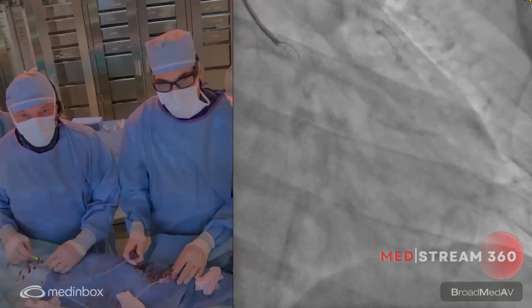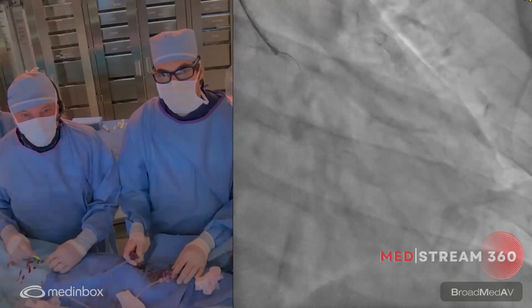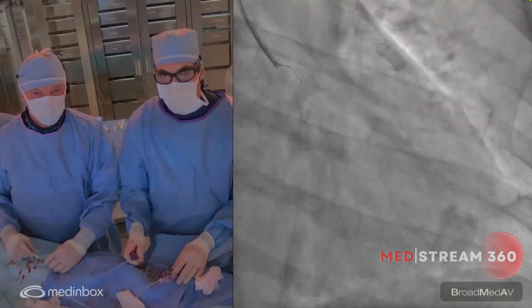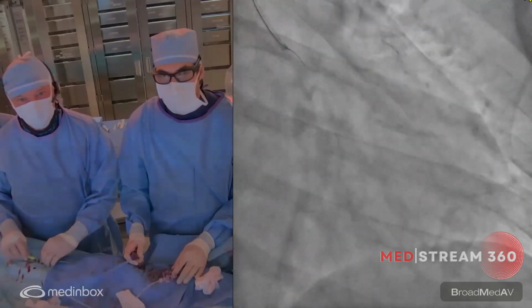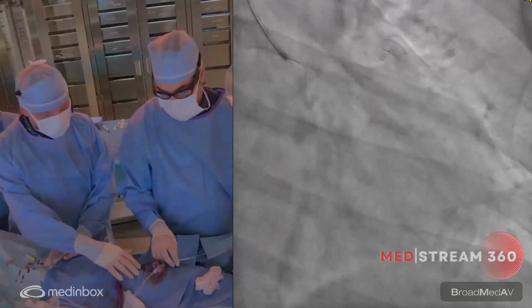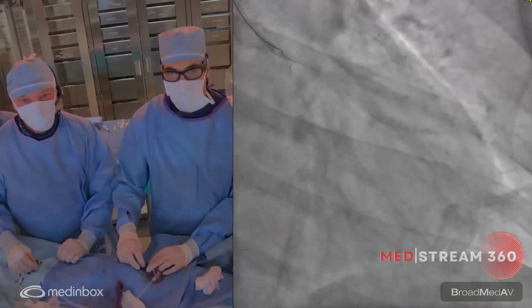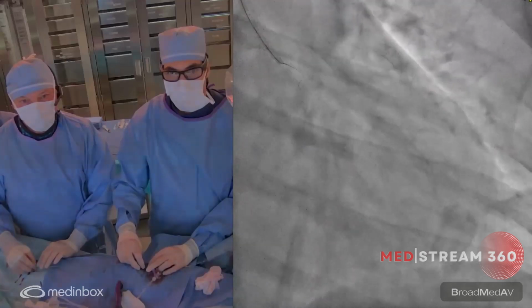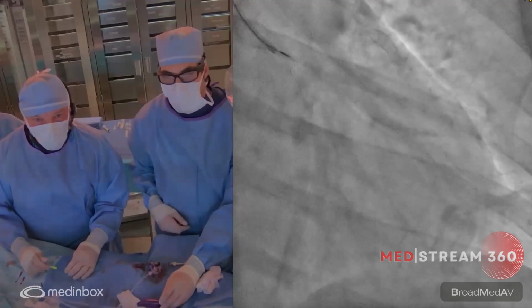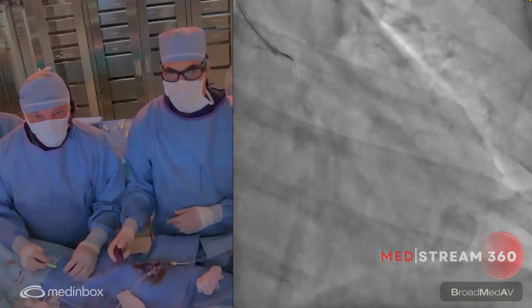Obviously the wire is usually very flexible in the microchannel also, hopefully to get back to the distal vessel. Okay, so that's the same problem when I'm on one side of the aneurysm. I need to go on the other side. I think you can appreciate the wire movement and the precision. And I change a little bit the tip. Is this one of the branches? No, not yet. No. That's coordination to try to get to that lumen. Still not sure. I see the catheter. As we need, we can change the tip, we can change the wire. For now, I think it's well engaged.